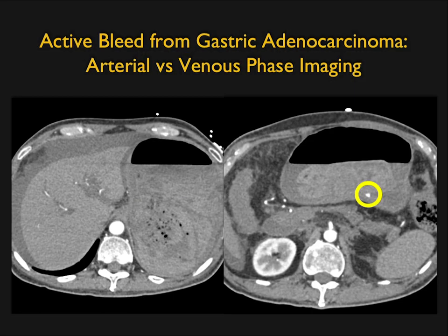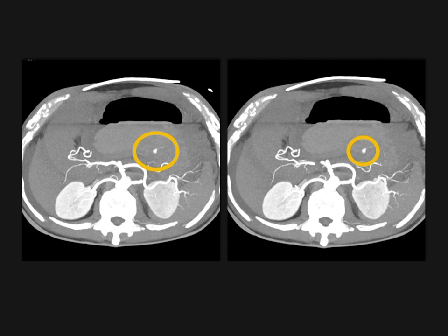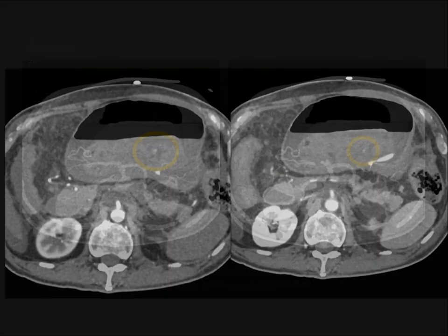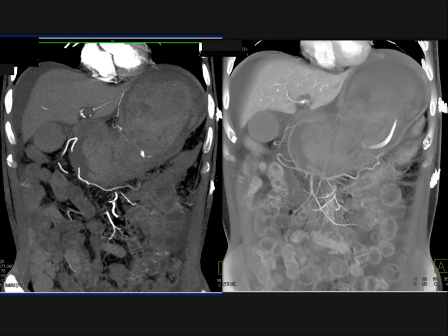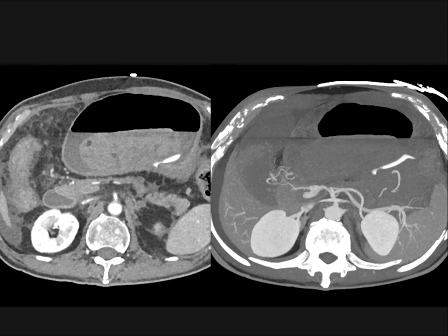Here's a patient example. Looking at the stomach, the fluid is of increased density on the left image. You need to be careful because certain medications like Maalox can make the stomach dense. On the right image, a circled site shows active bleeding, also nicely seen on MIP imaging. This patient had an unsuspected carcinoma. Going from arterial to venous phase, you can see the vascular jet of the bleed, and in 3D reconstructions you can see the blood in the stomach, the source of bleeding, and the thickened posterior gastric wall.